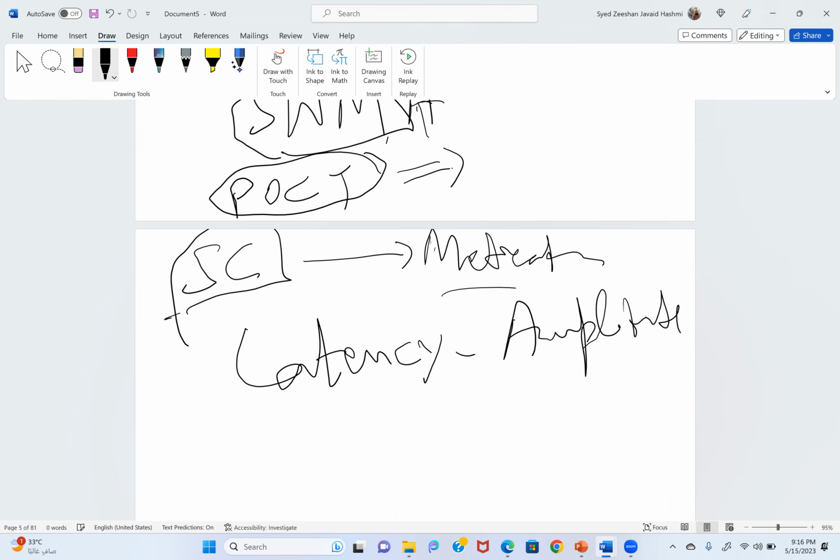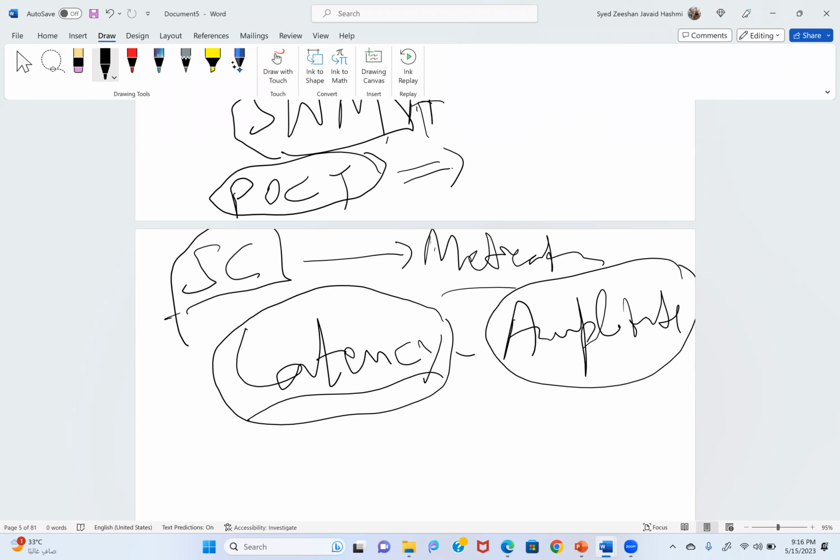Okay. So if you are trying to provoke someone, the time in which he replies to you is the latency, and how strong his reply is, is the amplitude. Okay, so this is just a concept with reference to evoked potentials, latency and amplitude. So you have to consider the medications which can affect that. As a general concept, usually we are using TIVA, and I have conducted a number of surgeries in which they are doing neurophysiology monitoring, not only neurosurgery, spine surgery, but also scoliosis surgery.